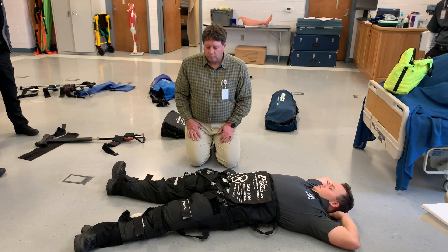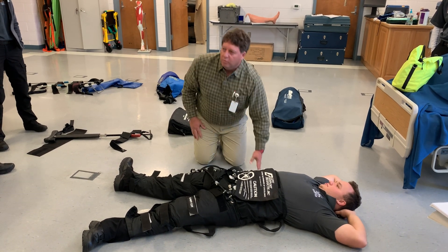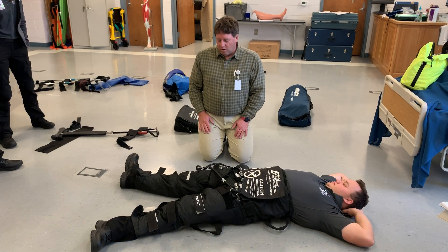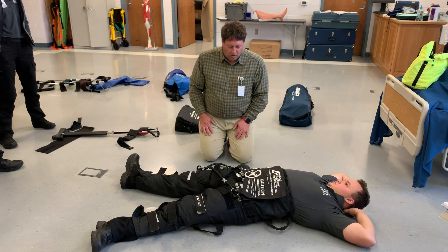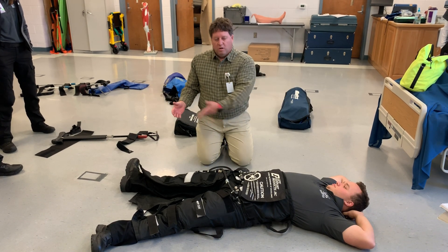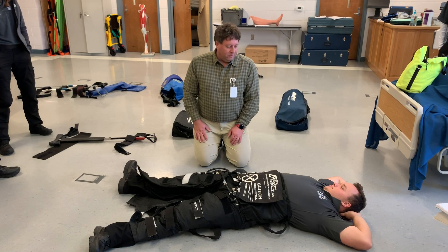When you get to the hospital, you can release pressure gradually using the valves. These are pop-off valves — if you put too much pressure in before you cause harm, they will release automatically. Notice the 'do not cut' warning: we don't want these cut off the patient because they're very expensive, and we don't want hospital staff to just start removing them abruptly. As soon as you do that, all the pressure is released and blood flows back down to the legs — kind of like a compartment syndrome or compression syndrome. So those are MAST pants.